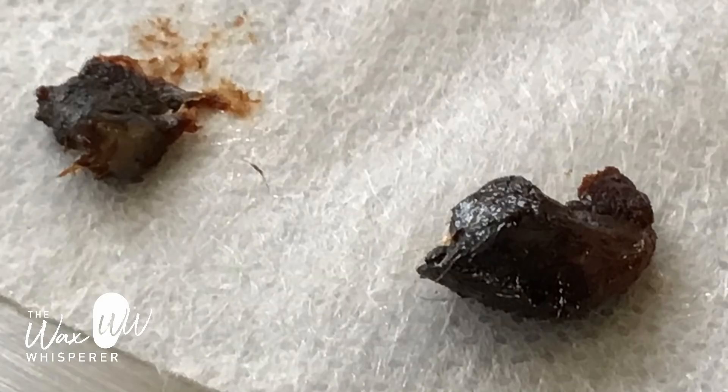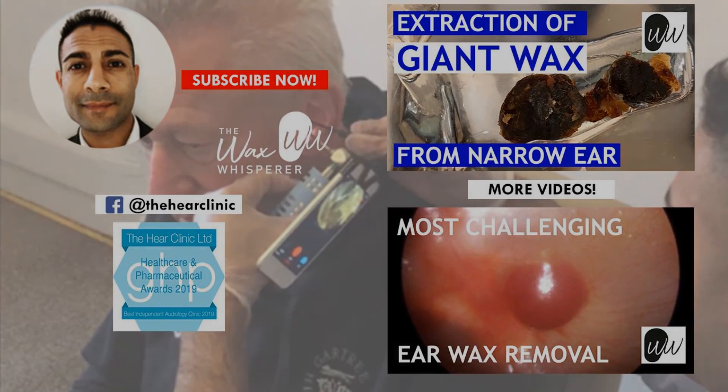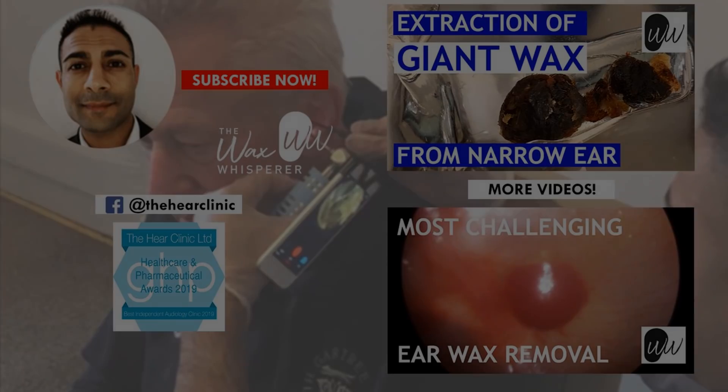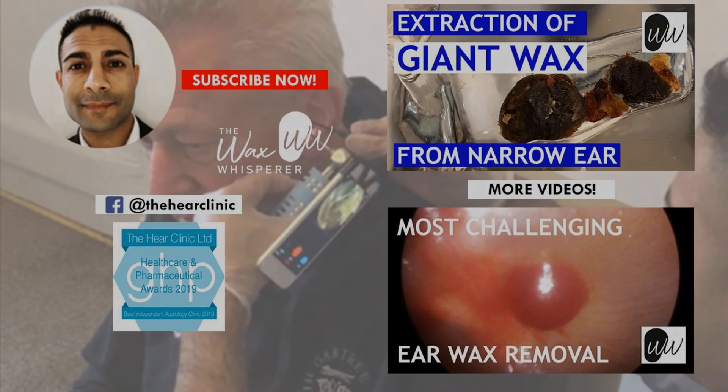Both eardrums are healthy. That's a close-up of the wax — someone asked for close-ups. I think the largest piece on the right was from the left ear, and the second piece on the left was from the right ear. Hope you enjoyed that video, guys. We're on a third lockdown here in the UK, so things aren't looking too great, but I seriously hope that wherever you are in the world, everything's going well and you're all keeping safe. Take care.